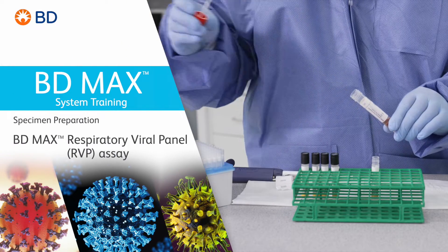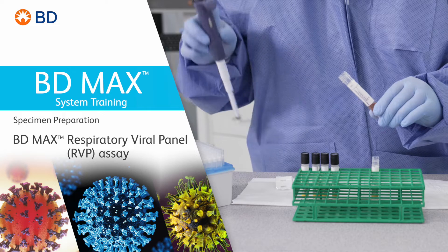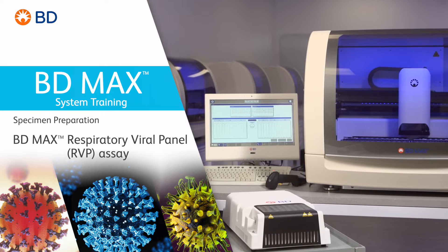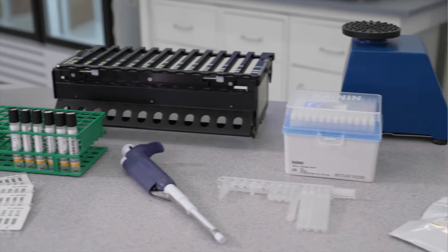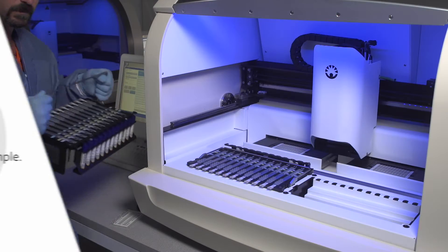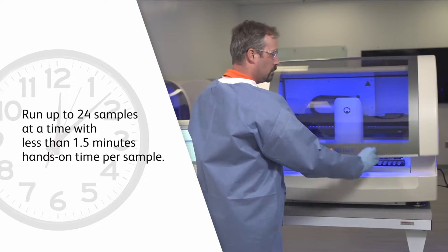Welcome to the training video on the basics of proper sample preparation for the BDMAX Respiratory Viral Panel, SARS-CoV-2, Flu-A, Flu-B, RSV, processed on the BDMAX system. The BDMAX system offers you a simplified and automated workflow, allowing you to run up to 24 samples at a time, with less than 1.5 minutes hands-on time per sample.